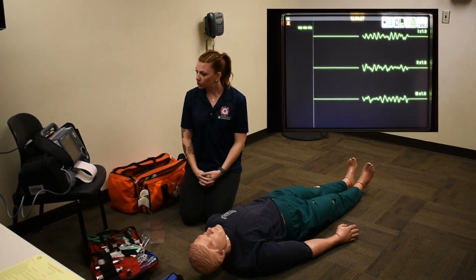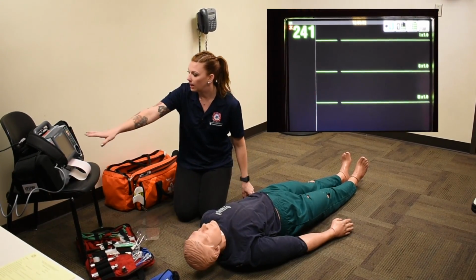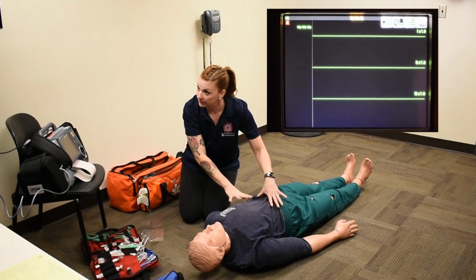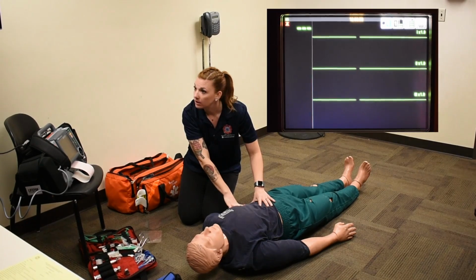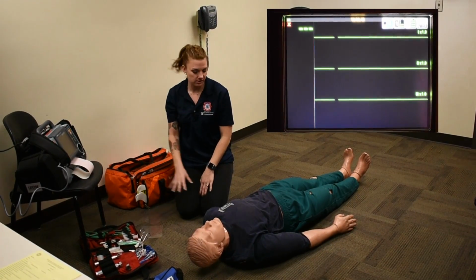2 minutes have passed. I'm going to check for a pulse. There is no pulse. It looks like asystole, but I want to turn up my gain, and I also want to check and make sure all my leads are on and the pads haven't come off. The leads are on. Okay, so again, we're going to continue CPR here. Okay, no shock at this time.